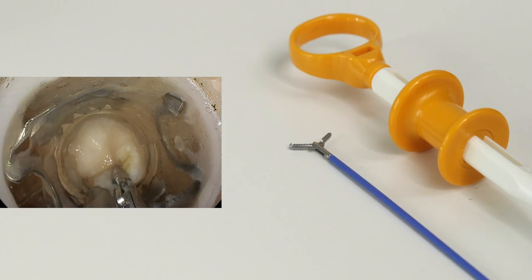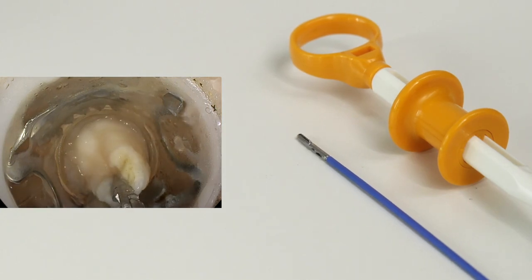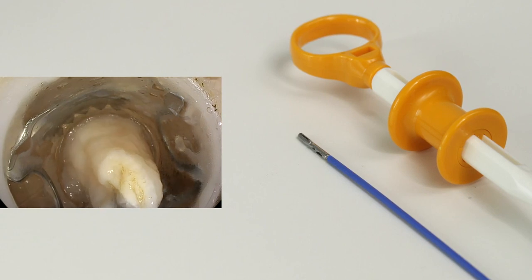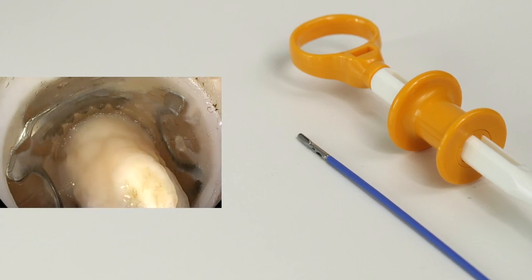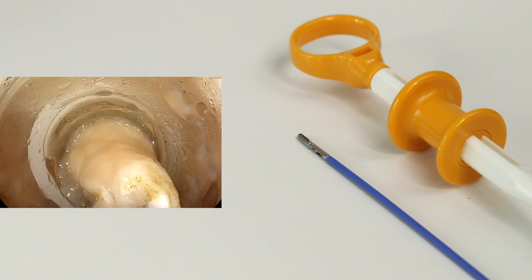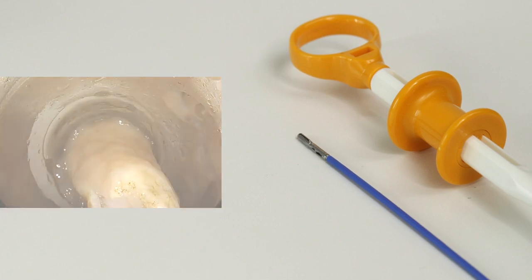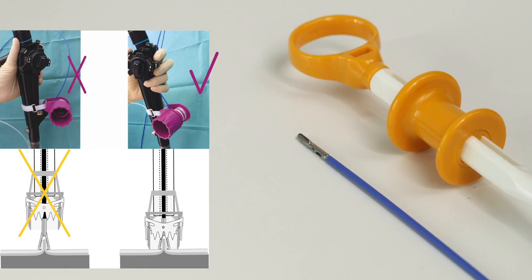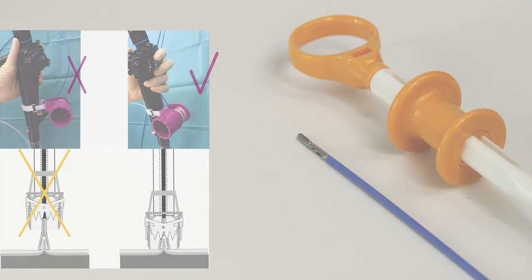When using the FTRD grasper, it must be ensured that the instrument tip is sufficiently drawn into the application cap and remains in this position while the clip is released. Otherwise, the clip may be applied to the instrument shaft or parts of the branches, and the instrument may become attached to the tissue as a result.